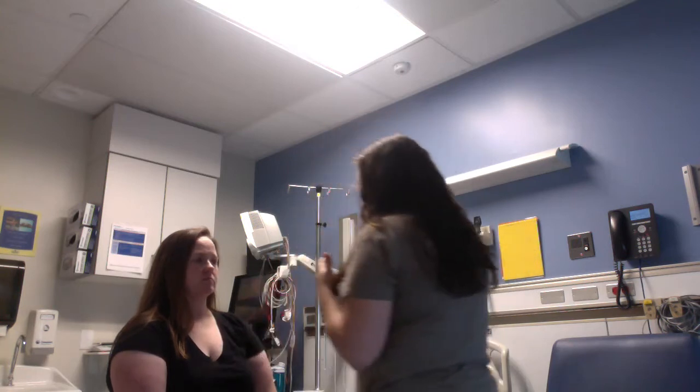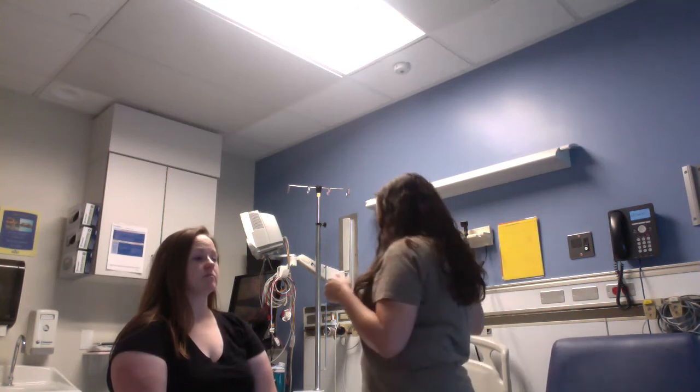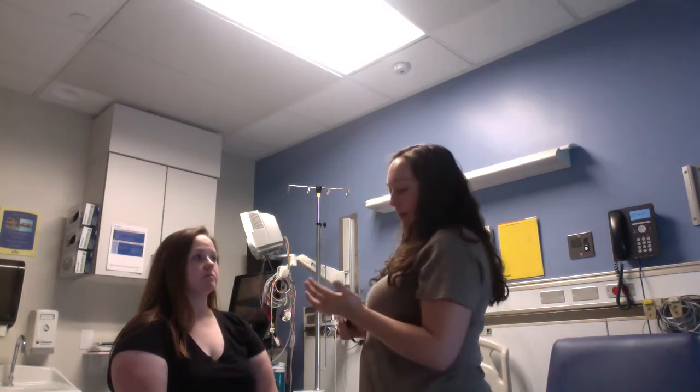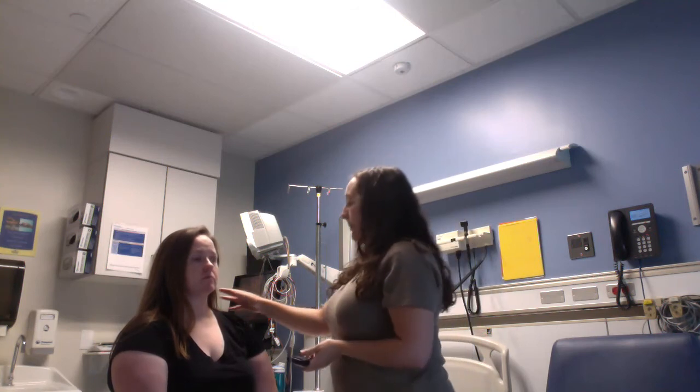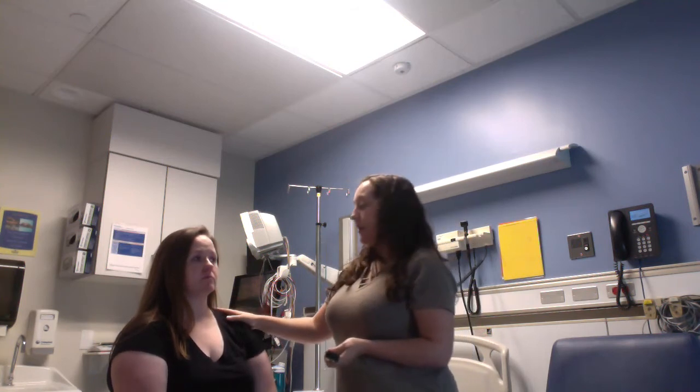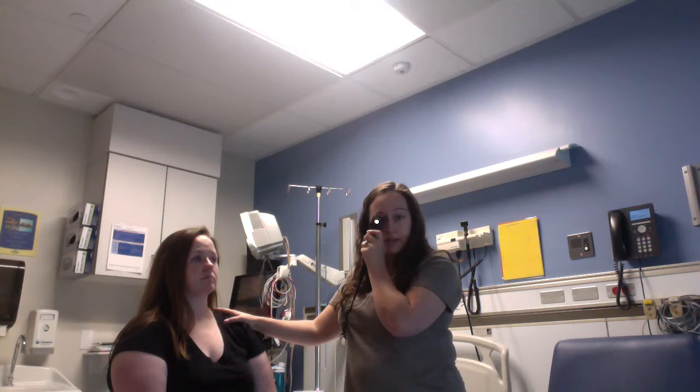All right, so next we're going to take the ophthalmoscope and we're going to do the fundoscopic exam. So with this one, we're going to get a little bit closer now. So I'm going to put my hands on the patient's shoulder. We're going to get at a 15-degree angle. And I'm going to make sure that the ophthalmoscope is up to my eye.